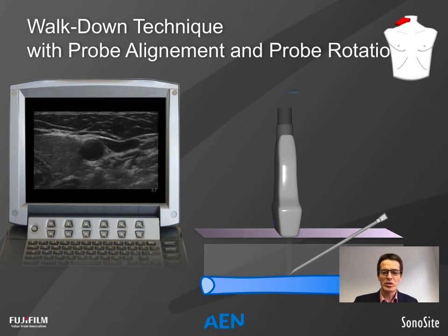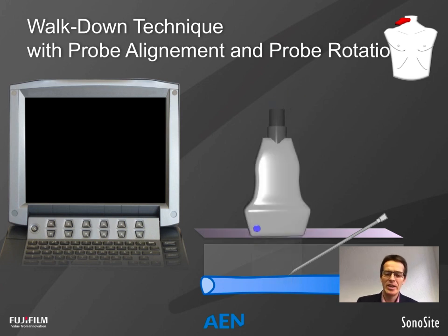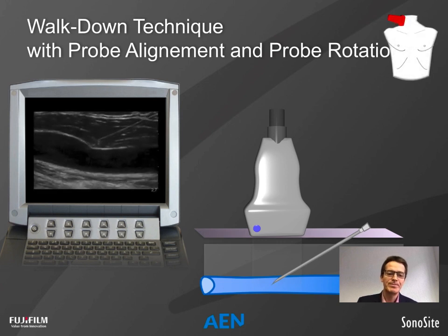First of all, you rotate the probe. So we had a short axis view before and an out-of-plane needle approach, and now through the probe rotation we get an in-plane picture of the needle and a long axis picture of the anatomical structure. And then we can insert the needle under full vision, and you see this on the ultrasound image here.